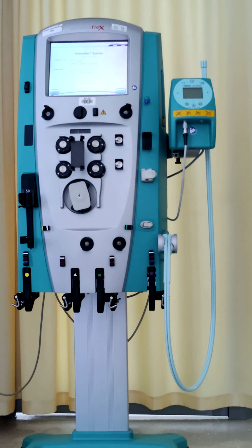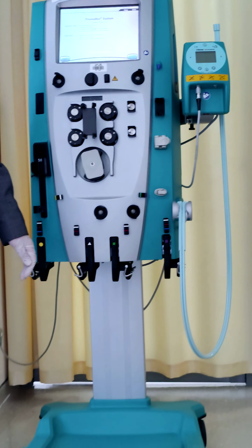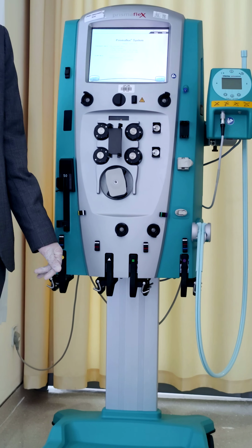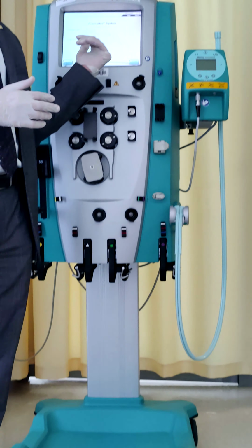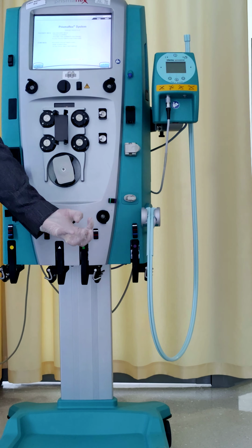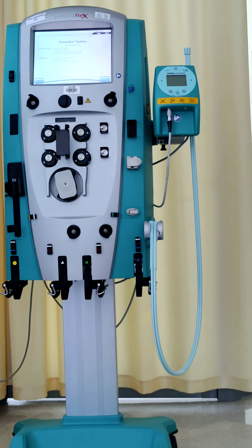And what will we do with the remaining one, manually? Yeah, perfectly. This is a very good comment. First, I have to know what is the volume size, and I will put it on the machine. But before putting, I have to put it less than 10% from the real volume. What is the benefit of this 10% less? To avoid any air embolism.